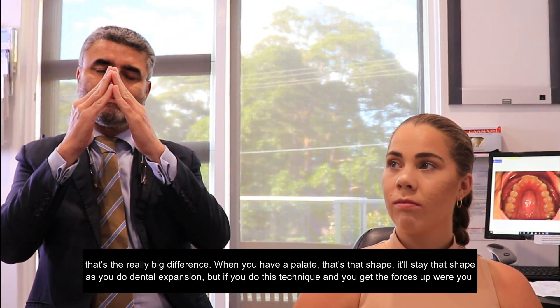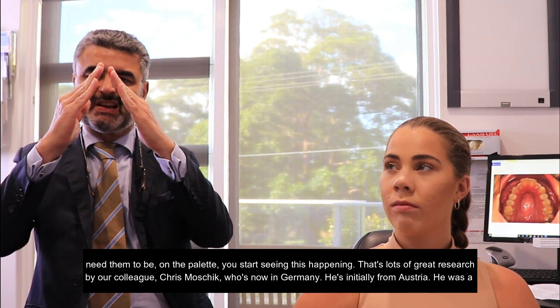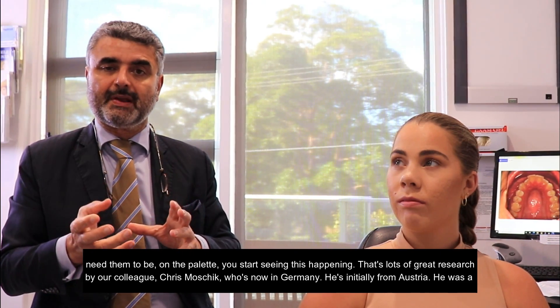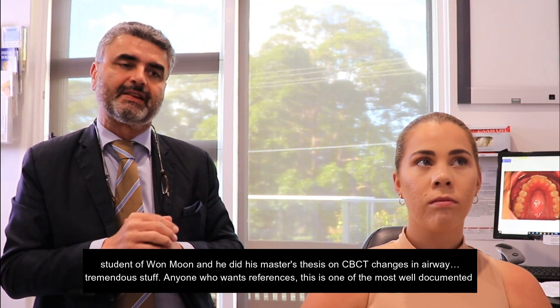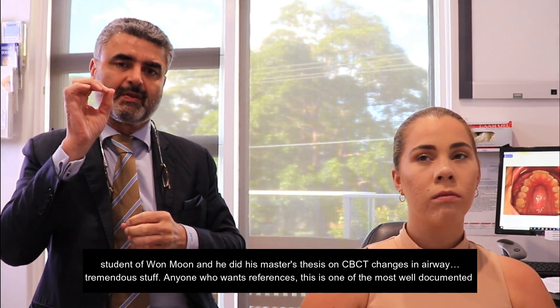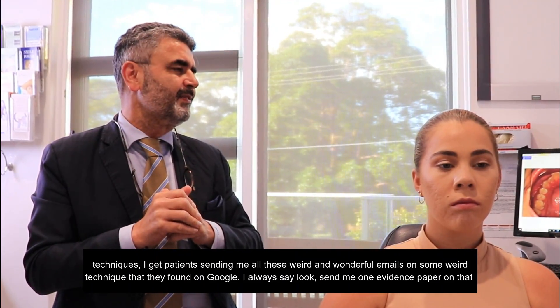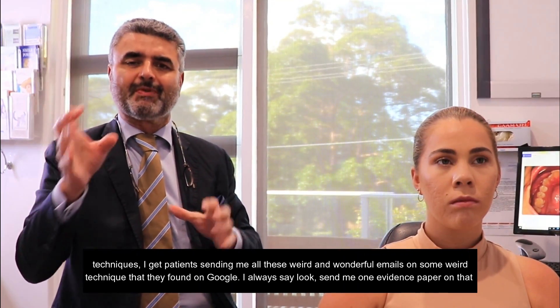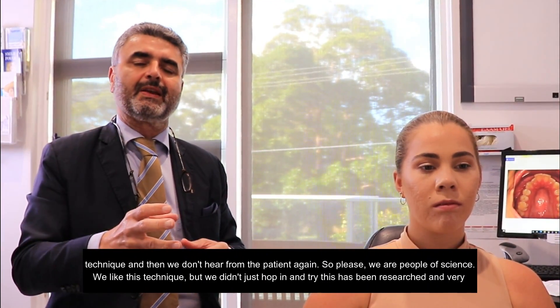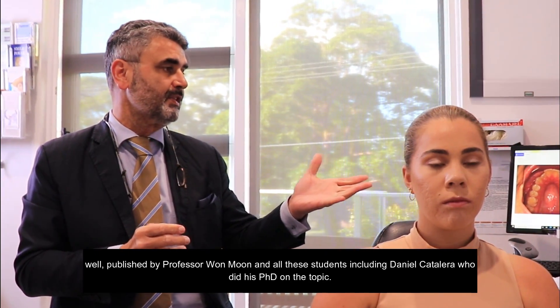When you have a palate that's narrow, it'll stay that shape with dental expansion. But if you do this technique and get the forces up where they need to be on the palate, you start seeing real change — and there's lots of great research by our colleague Chris Moschick, who's now in Germany. He was a student of Won Moon and did his master's thesis on CBCT changes in airway. This is one of the most well-documented techniques. I always say: send me one evidence paper on that technique — and then we don't hear from the patient again. We are people of science. This has been researched and very well published by Professor Won Moon and all his students, including Daniel Cantalera, who did his PhD on the topic.